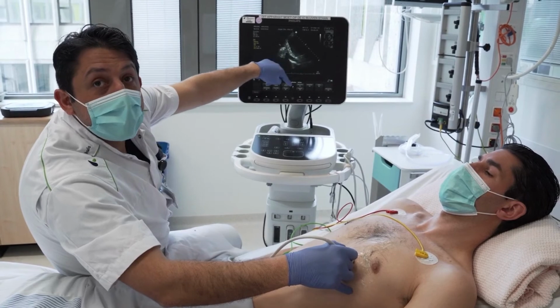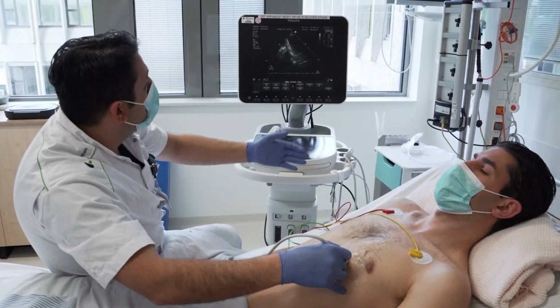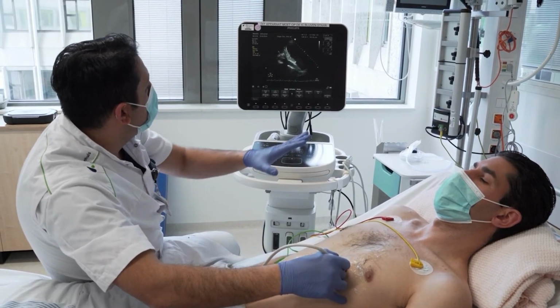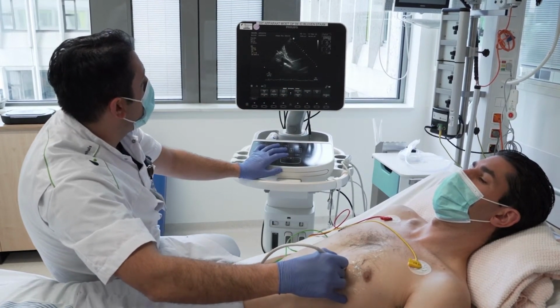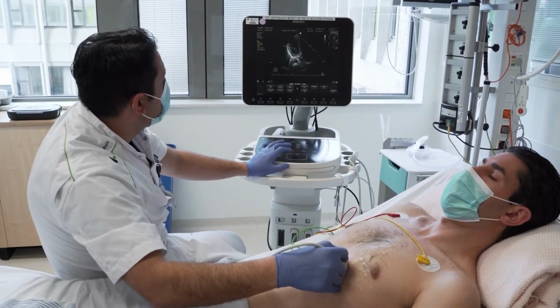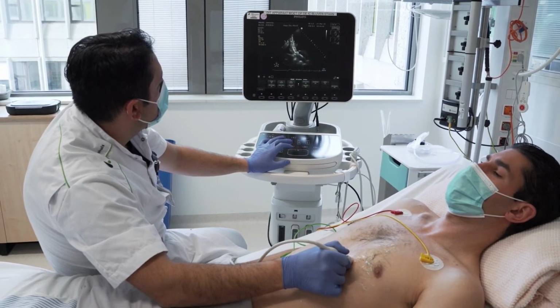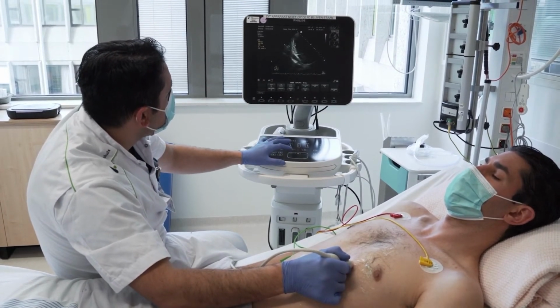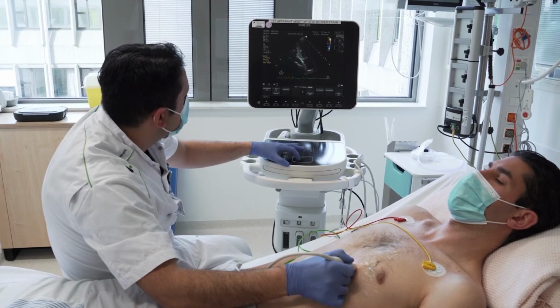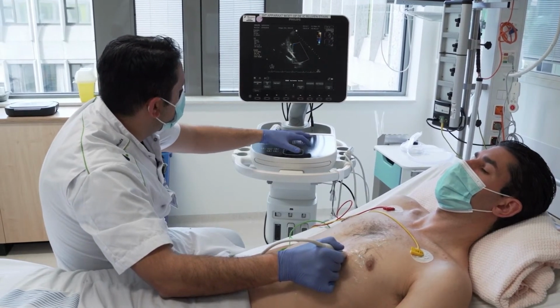For the anterior wall, you can ask the patient to take a deep breath. Can you take a deep breath? And then expirate and hold on. Then you will see more of the anterior wall. So at the end of the expiration, Sakir, yes. That's a very nice 2-chamber view with the mitral valve in the middle. You can also put a Doppler in there if you want for serious mitral insufficiency. But again, this is, I think, less interesting for the acute setting.